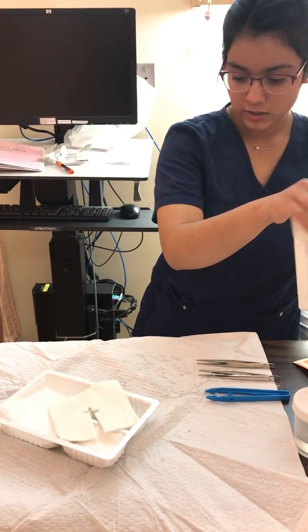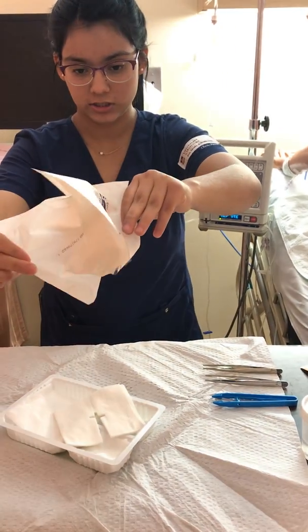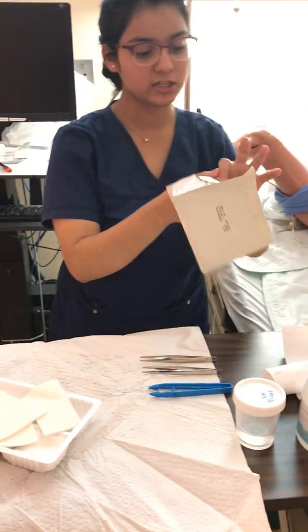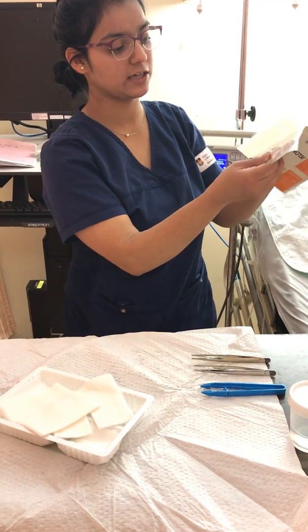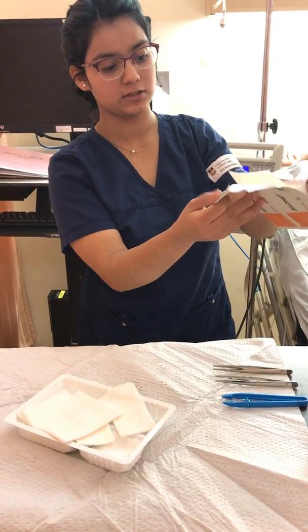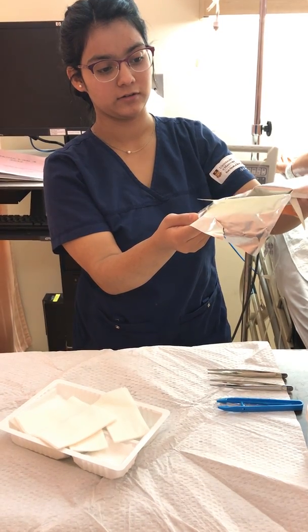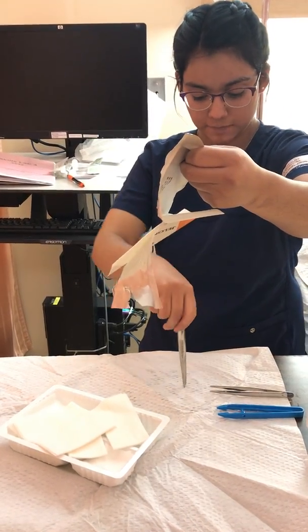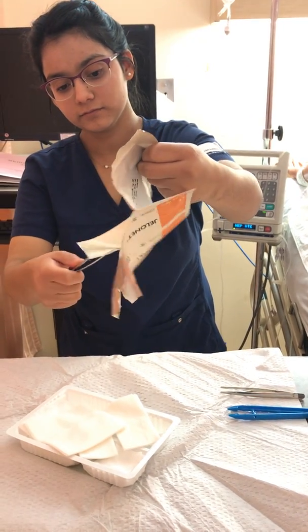I'm going to put some gloves. Just going to put some extra just in case, so I don't contaminate my sterile field. Beautiful. And now we're going to take our forceps, make sure that I stay sterile. I'm not touching any aspect of this. Can you put your hand up? Thank you. Open it like this, and we're going to take our forceps. Intact, taking out of subcutaneous emphysema, there's none.